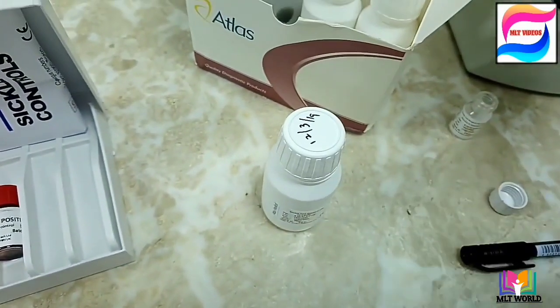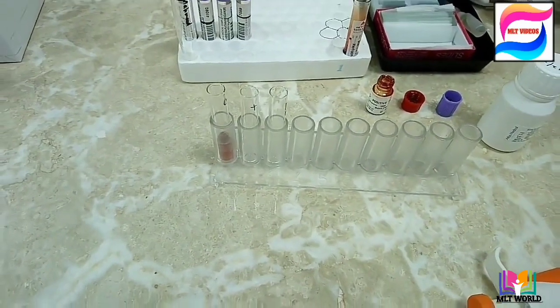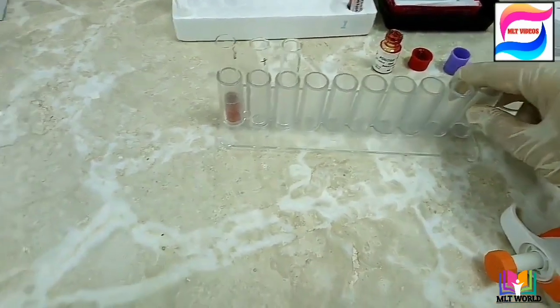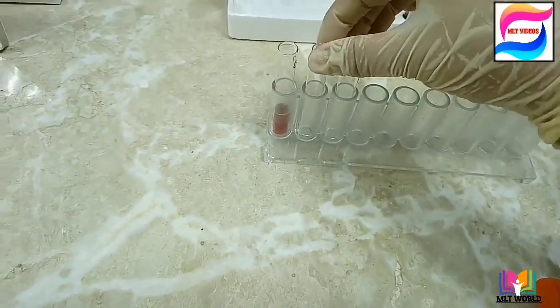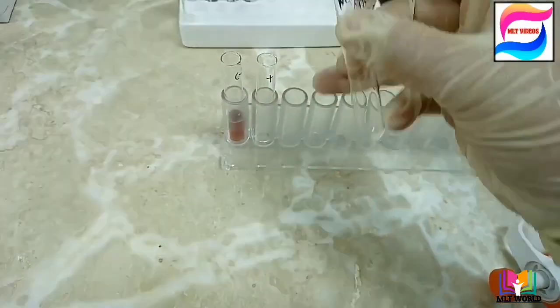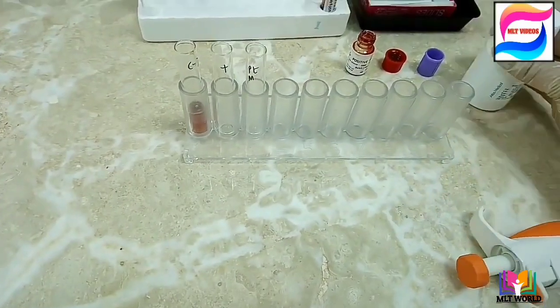After that, we need three tubes. Label the first tube as negative for the negative control, the second tube as positive for the positive control, and the third tube with the patient's name. If you have more samples, label them with each patient's name. Stand the tubes in a rack.